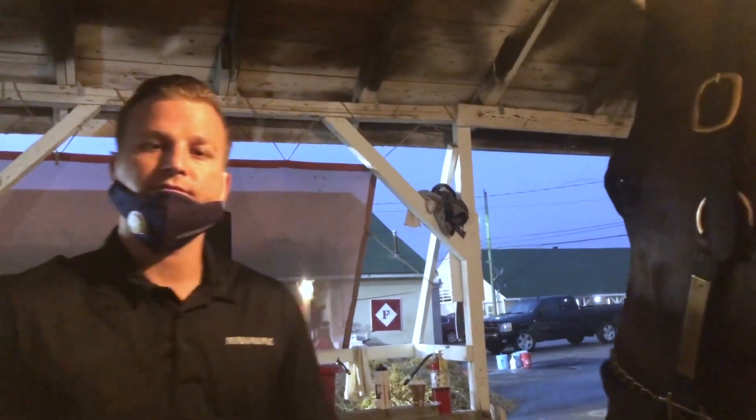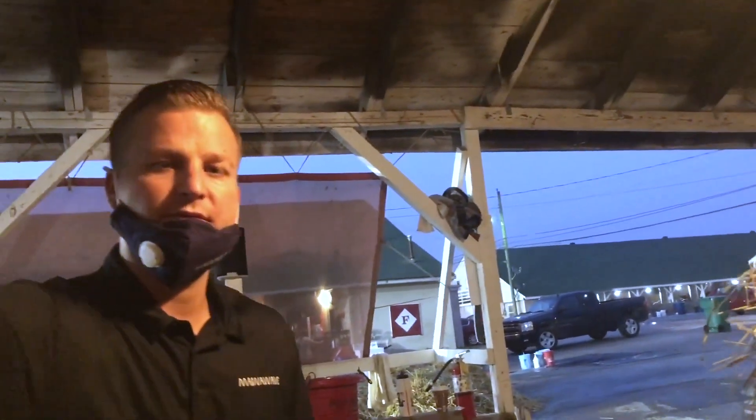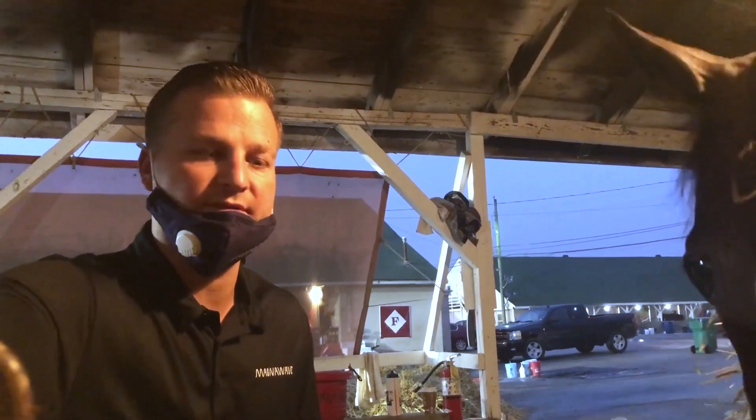When do you find it beneficial? You said this horse is using it pretty much every day, but when do you find it beneficial to address before a race, and timing-wise, how many days out? We usually do three — three kind of as a pre-race. And then sometimes after the race, or before and after a pre-race as well.